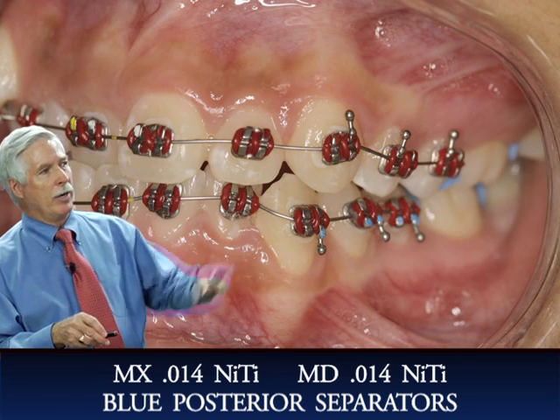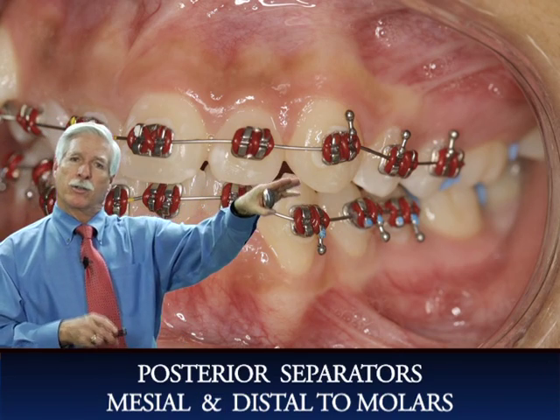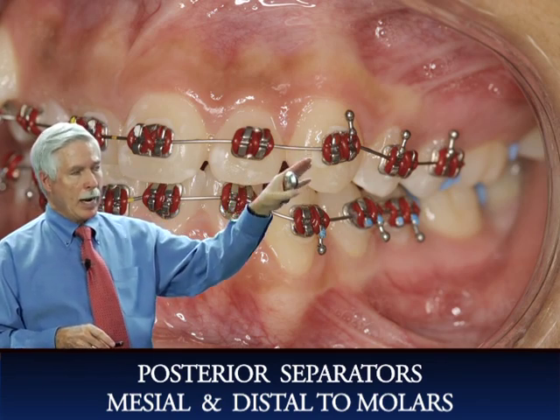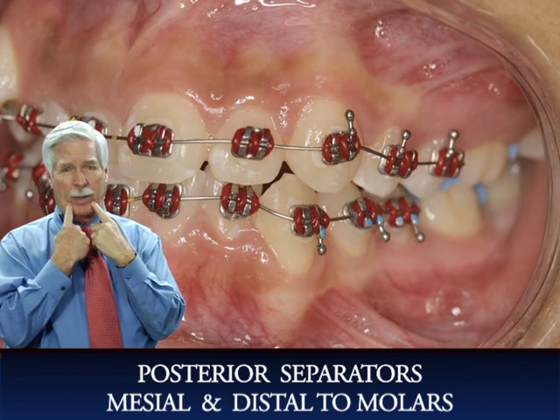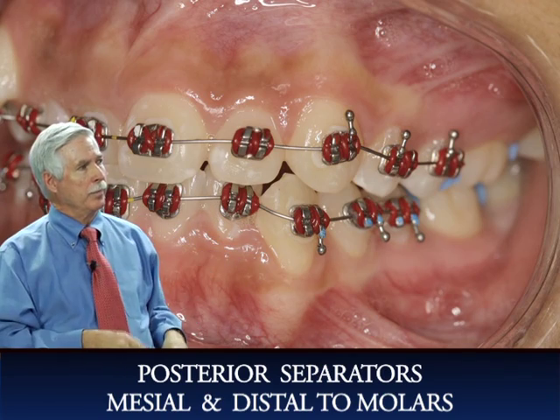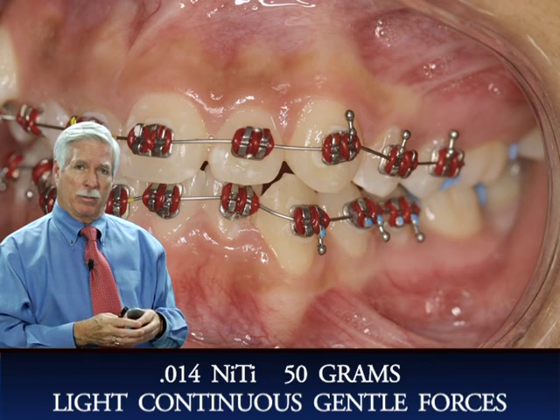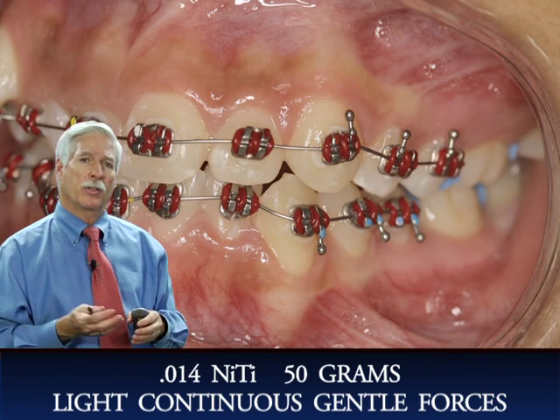And we've placed over here the blue separators. So the blue separators go in mesial and distal to the molars. So we've got the brackets on from 2nd bicuspid to 2nd bicuspid, upper and lower. The 014 nickel titanium wire, upper and lower, as you can see. Now those wires are very gentle, 50 grams of force.